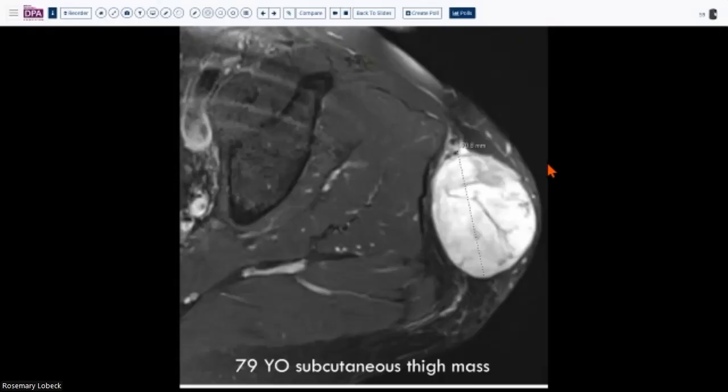So here is a case in comparison though. So this time we have an older patient, nearly 80 years old, and the mass is subcutaneous. So it's not a deep mass, it is subcutaneous, but it's quite large. It's nearly 7 centimeters, and it also has this MRI signal that extends beyond the border of the mass, seemingly infiltrating into the septations around the adipose tissue over here.